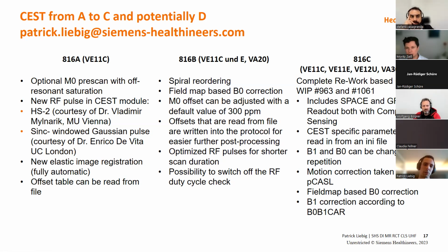This was similar to Moritz's C2P, where we had this restricted slab that we can acquire, plus the possibility to acquire a field map upfront, basically in an adjustment step. This is why it's called B, or at least in retrospect I realized that this kind of matches, because this was the first time we implemented a B0 correction in it.